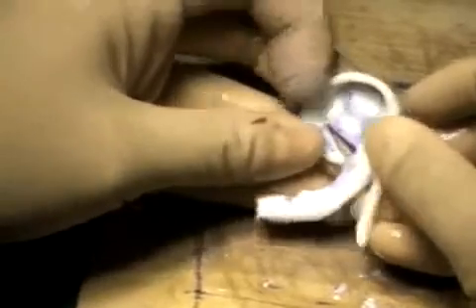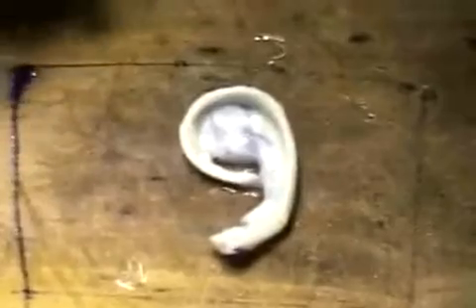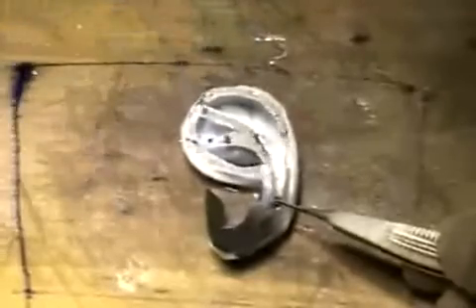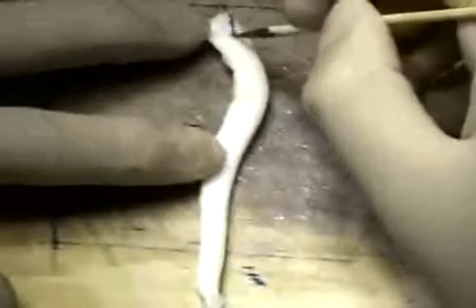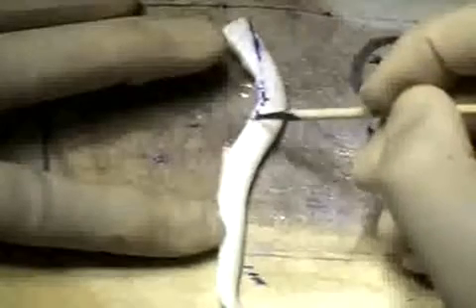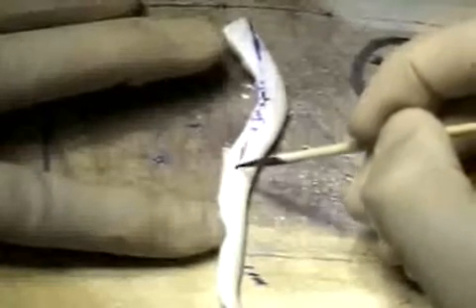A nice smooth curve is created as shown. Attaching the helical rim portion is now completed. Again, the template is used to check the accuracy. Attention is turned to the anti-helix. Dr. Yamada is marking the incision design on the ninth costal cartilage. It is important to preserve the natural smooth curve of the lateral aspect of the cartilage.